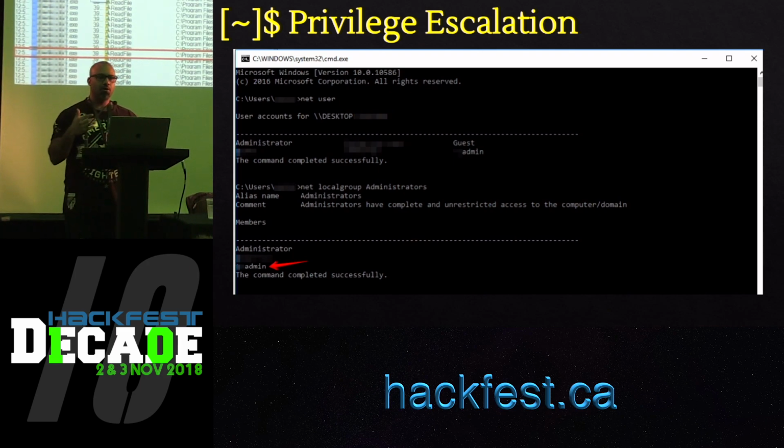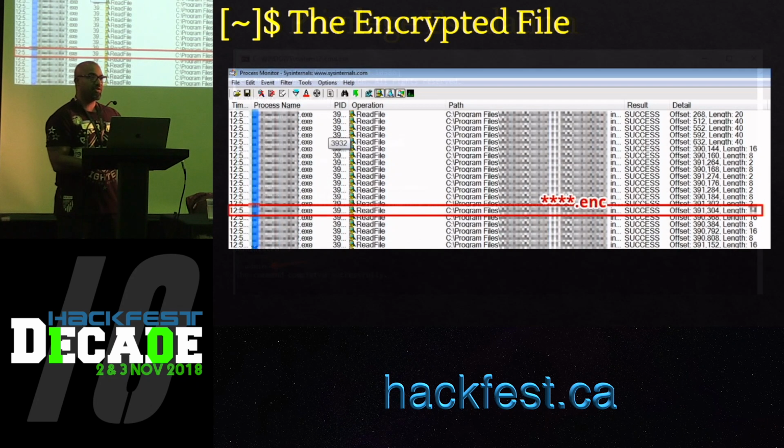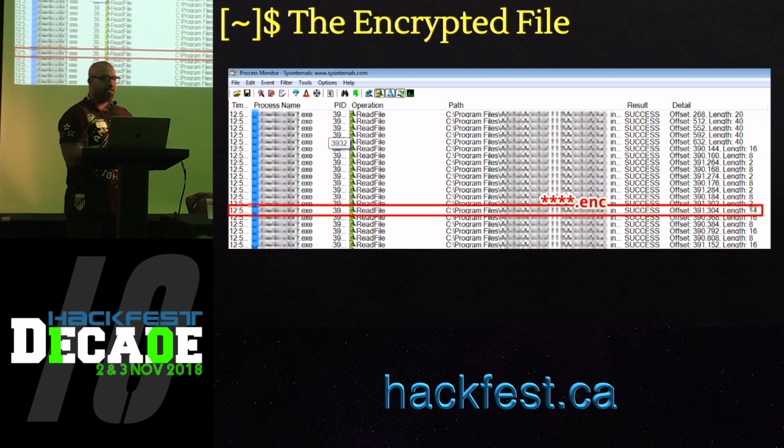And if you've worked with Procmon before, you will see that it captures tons of events. Surely you can filter it per application, but still there are a lot of events that are captured by Procmon. It basically monitors file operations, memory operations, registry operations performed by an application. So we started monitoring that.